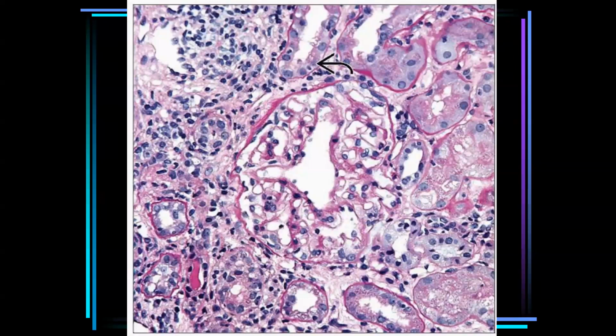As we said before in our lectures, the type of the infiltrate present in this picture and in similar pictures of tubulointerstitial nephritis doesn't differentiate whether it is acute or chronic. Differentiating acute from chronic tubulointerstitial nephritis is mainly dependent upon the history.